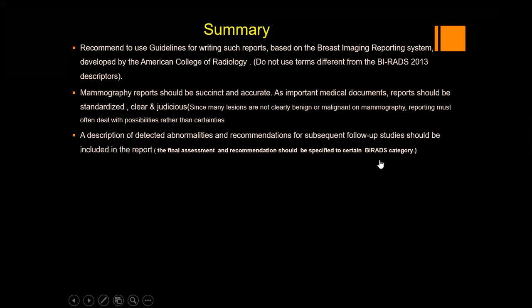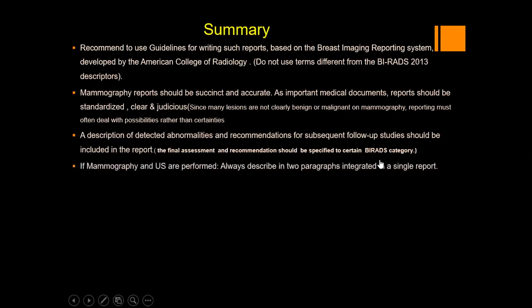The final assessment and recommendation should be specified to certain BI-RADS categories. If mammography and ultrasound are performed, always describe in 2 paragraphs, as we have seen in the report, 2 paragraphs in the same integrated single report.